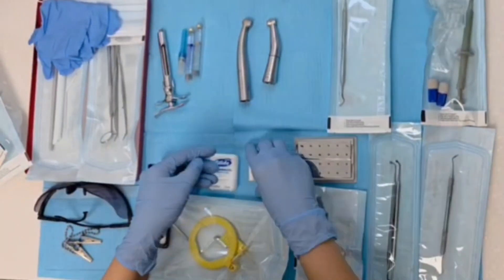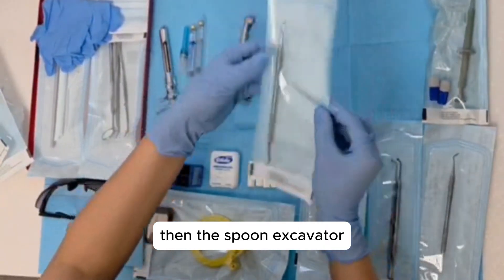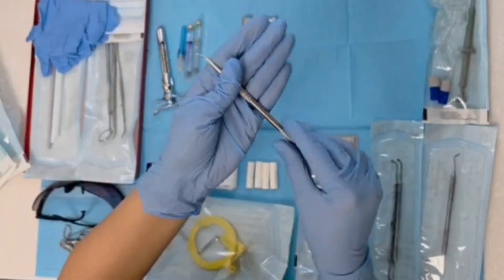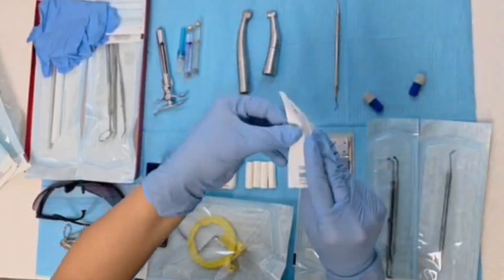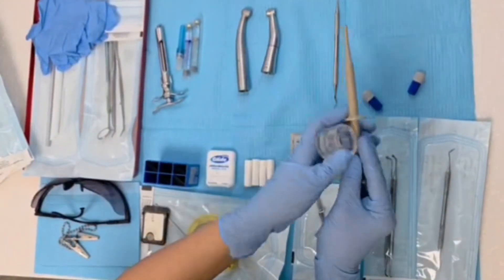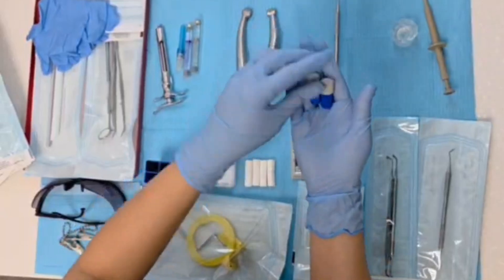Then we will set up some cotton rolls, then the spoon excavator. Then we will set up the amalgam gun. This is the amalgam gun, the dappen dish, and the amalgam capsules.